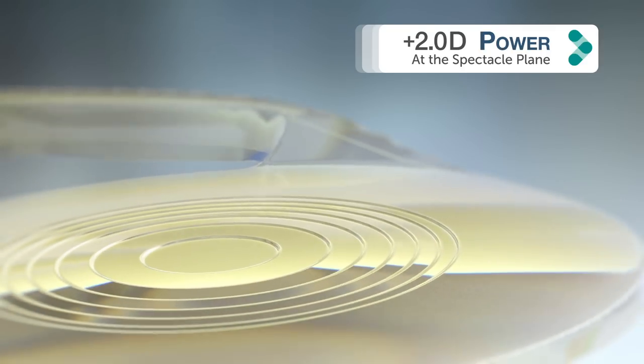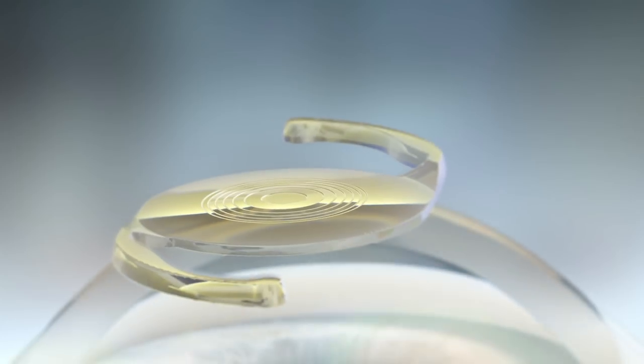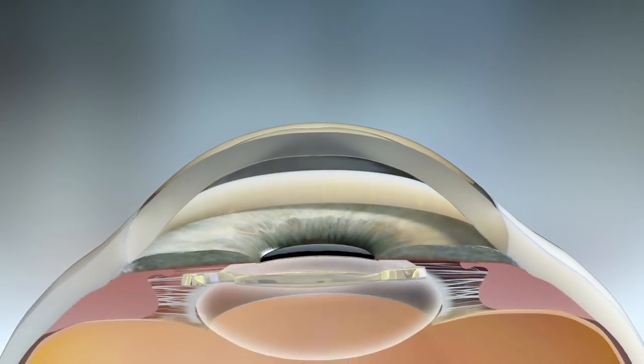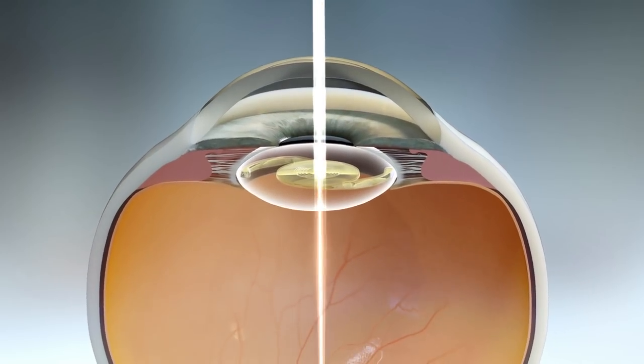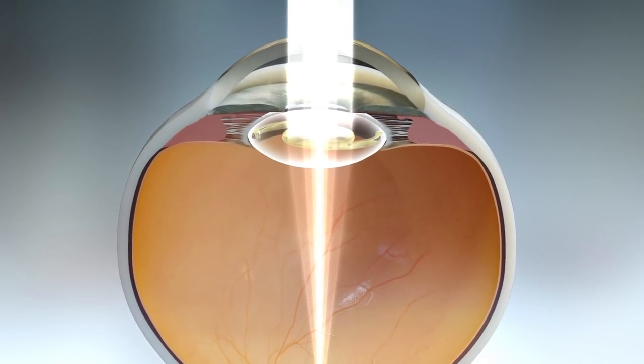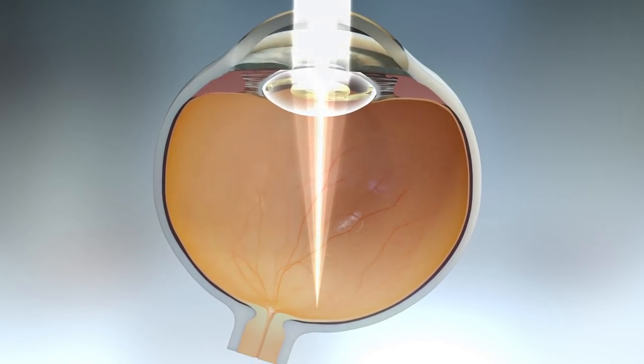The central portion is entirely dedicated to distance vision, and unlike traditional multifocal IOLs, it directs a high percentage of light to the distance focal plane. Combined with negative spherical aberration, this results in contrast sensitivity comparable to the number one selling Acrosoft IQ monofocal IOL.